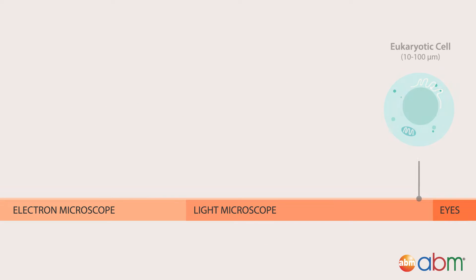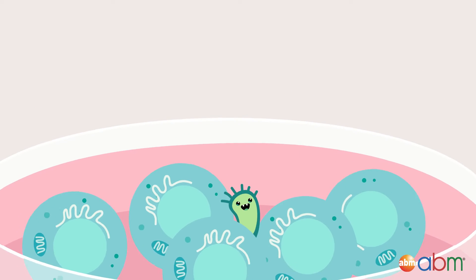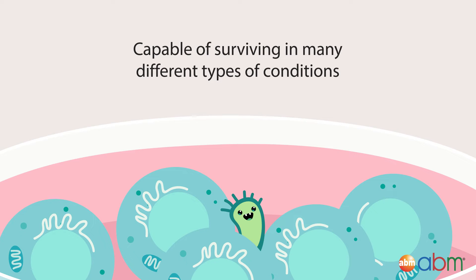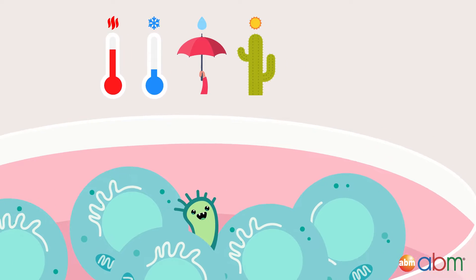Bacterial organisms are extremely small — smaller than the size of eukaryotic cells. This makes them difficult to detect under the microscope until the contamination is full-blown. Not only are they small, but they're also capable of surviving in many different types of conditions, whether it's hot or cold, or wet or dry, which makes them challenging to get rid of.